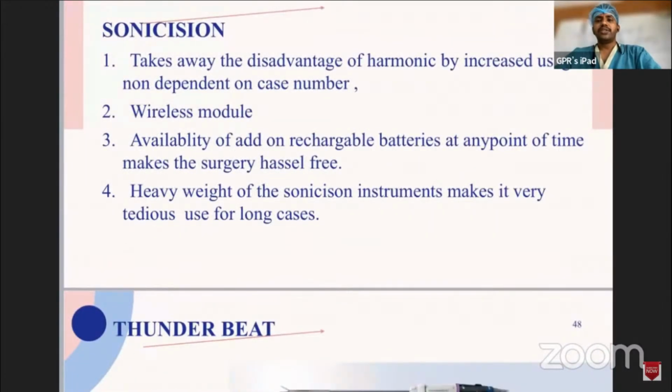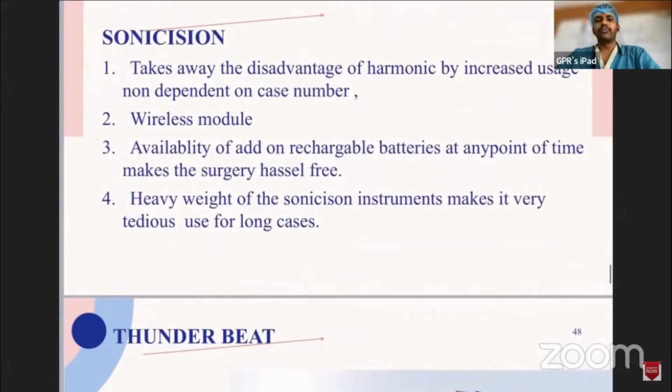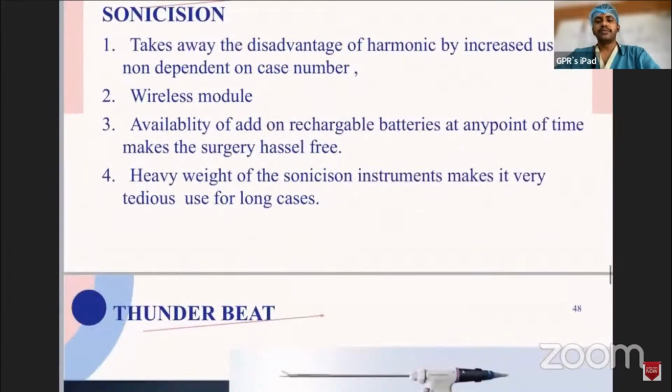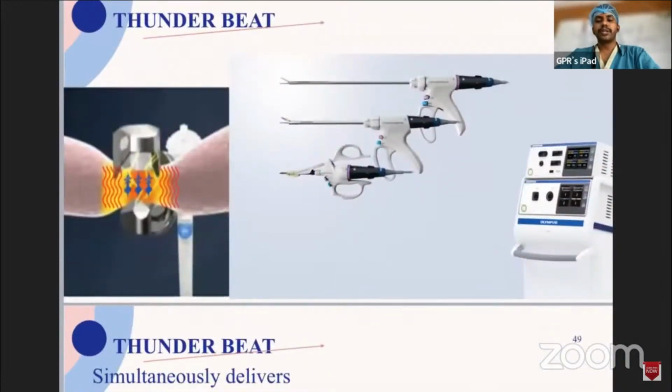The only disadvantage is that it is heavyweight, and it is very tedious to hold for longer cases. Whenever we feel like we are running out of battery, we can change the battery then and there itself. So it doesn't depend on any external energy source, other than the battery to get into action.